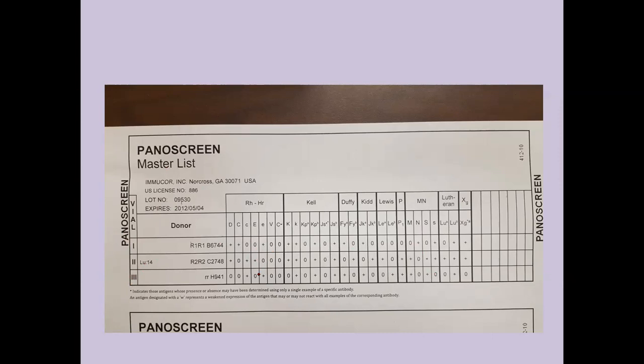And we look at screening cell 3 and we see no big E and no big N. So would they have reacted with that one? No. So we can go back and look at these reactions after the fact and see if they make sense.